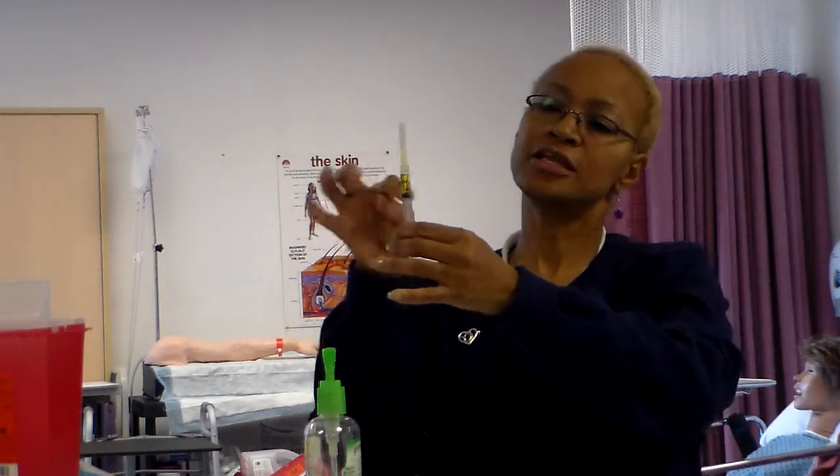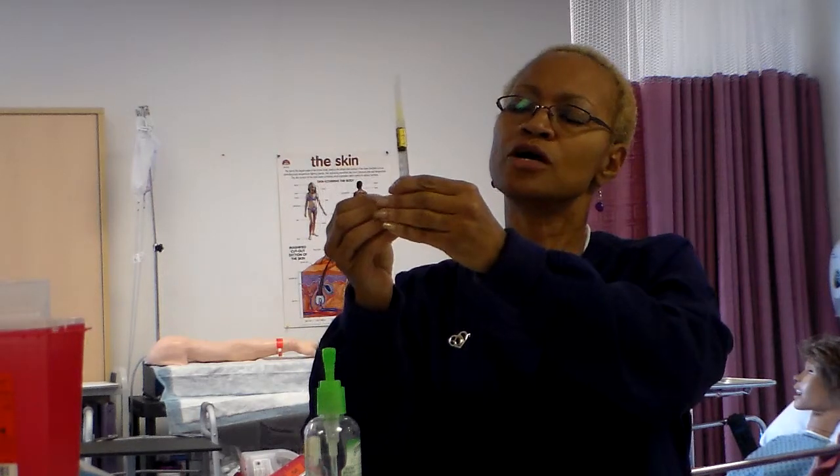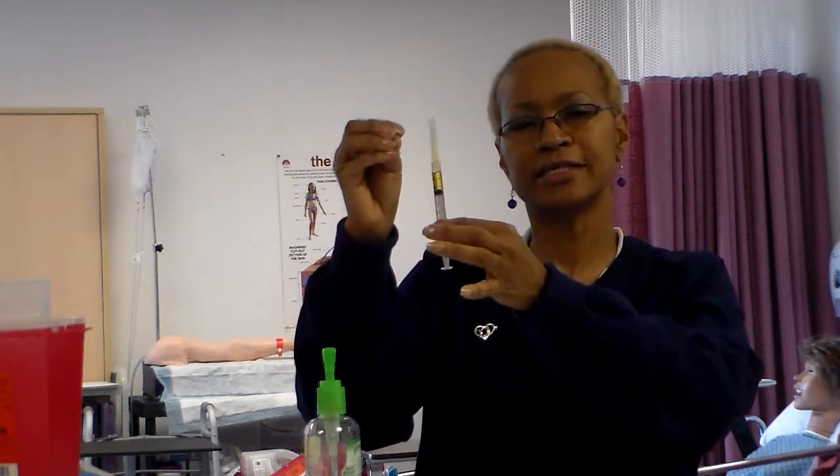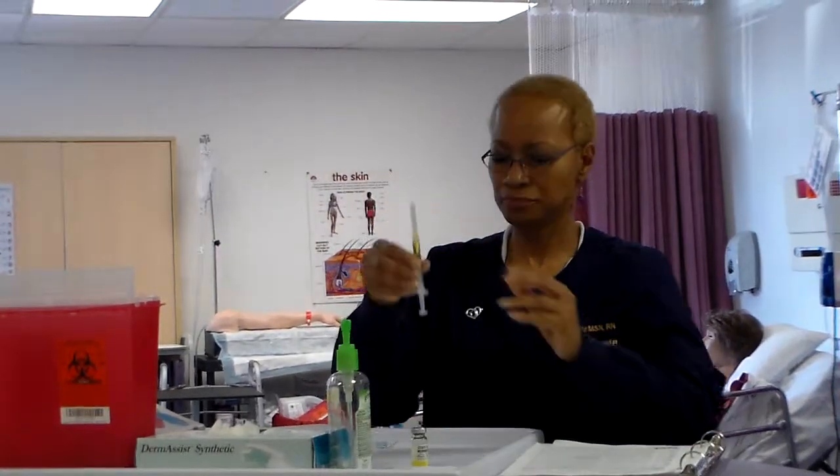Okay, so if you're doing that, and let's say you did have air bubbles at the bottom, before you pull back, you tap and the air goes to the top. You now have to pull your plunger down to get all your medication that was in the needle, in the hub, down into your syringe, and now push out all air up to your correct volume. Here we go. Make sure everything is good before you set that syringe down.